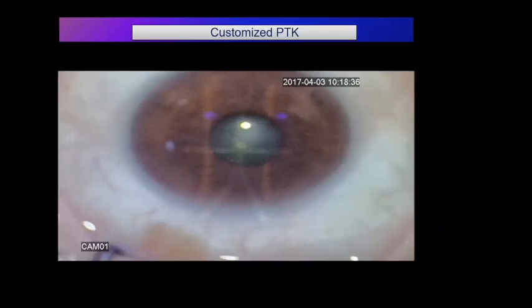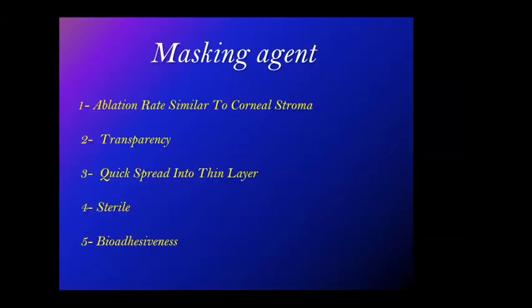Another question. Is this 55 micron that you mentioned after epithelial removal or included? After. No. Epithelium here is my friend, my dear. So you start on top of it. You don't remove it mechanically. As long as there is epithelium, I'm not in danger. As long as there is fluorescence, so there is epithelium, I'm not in a bad position.